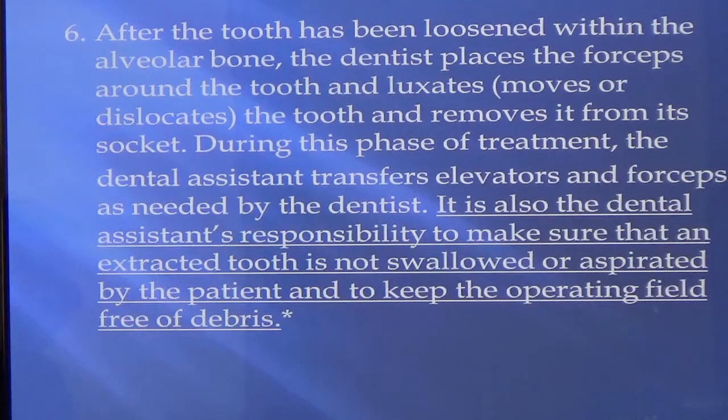Your responsibility when we're doing this is, again, sometimes these teeth have large fillings, sometimes these teeth have crowns, sometimes these teeth will break. As an assistant, you have to be ready there with the suction, because your main job there really, you're going to be suctioning on the blood so we can see.